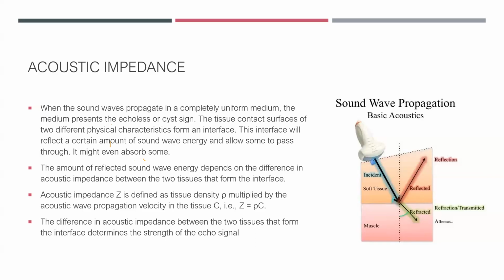By brighter, you mean whitish or so? No, that's not correct. What I would say is that this is resolution that we're talking about. We're not talking about echogenicity. I'll come to echogenicity. Give us some time, and that'll clarify your concepts a little bit better. But the next thing that I want to talk about is acoustic impedance.